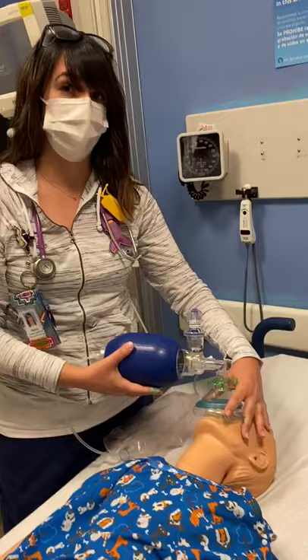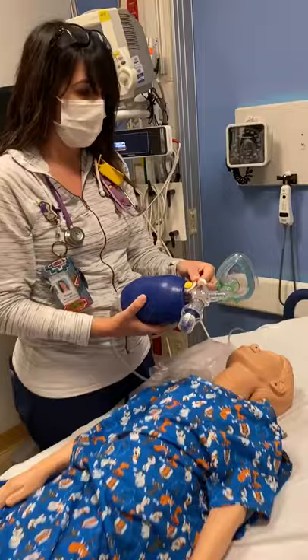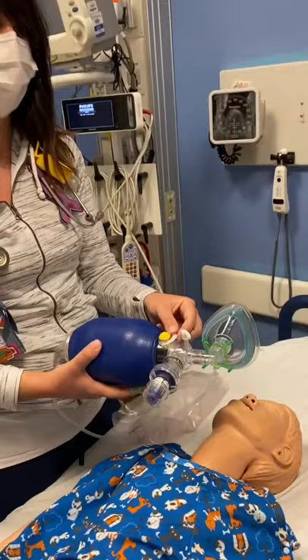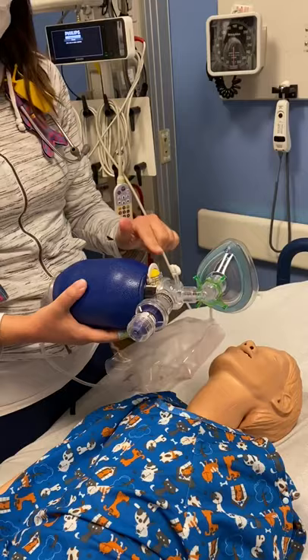This is the pop-off valve. It is a protective mechanism — if a patient has some constriction, it stops you from over-inflating the lungs. If you need to go up on pressure greater than 40, you'll want to unlock the pop-off valve. But before doing this, speak to a physician.